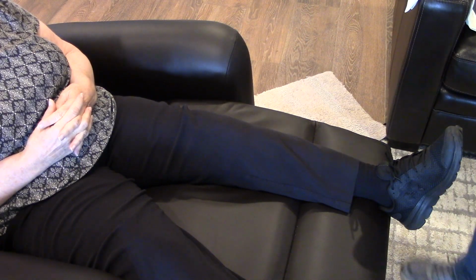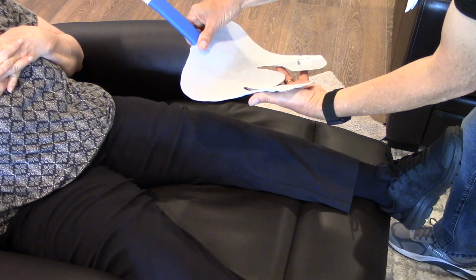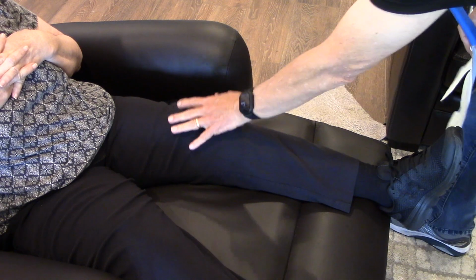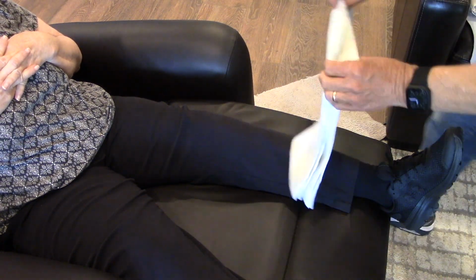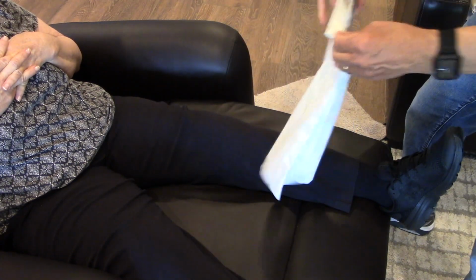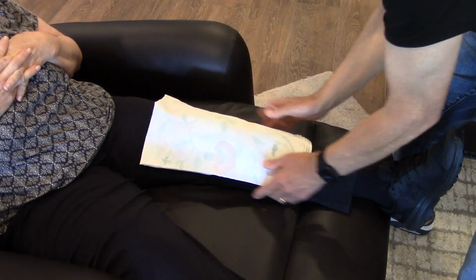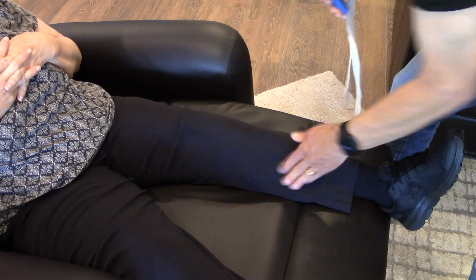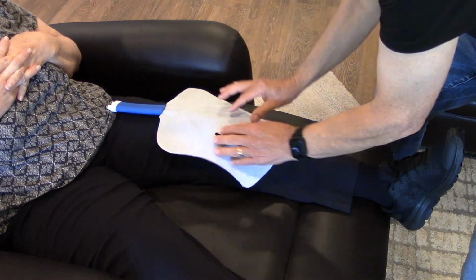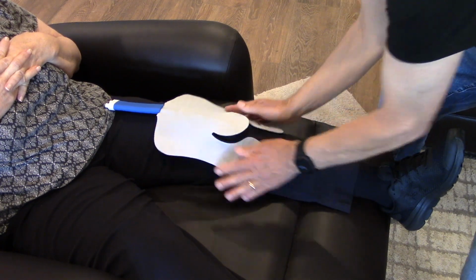Now, we learned a lot about wrapping the pad actually on the knee. If you're doing it right on the bare leg, we found that using the pillowcase, maybe doubled over on itself, laying there would prevent too much cold coming upon the flesh. So we here are using it through this fabric, and you can see there's a place where the patella sits, and you can wrap this around.